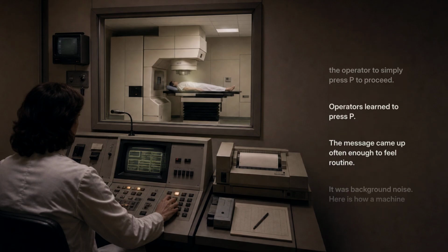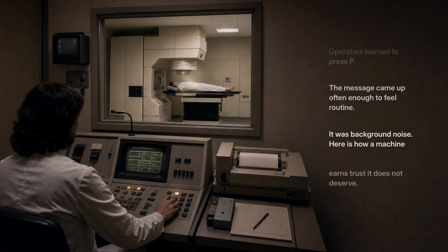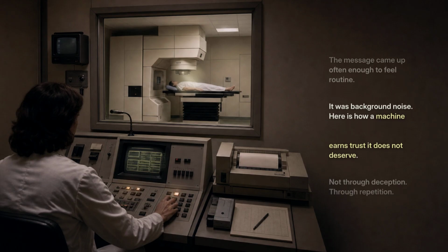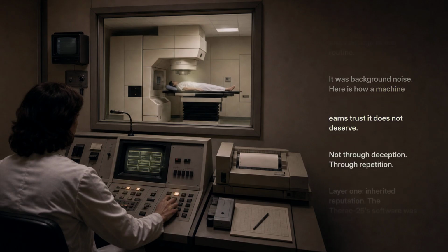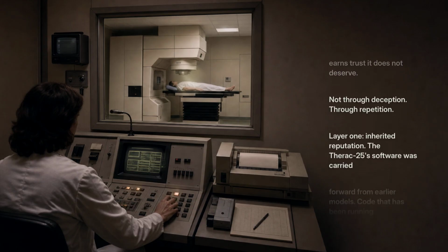Operators learned to press P. The message came up often enough to feel routine. It was background noise. Here is how a machine earns trust it does not deserve. Not through deception, through repetition.